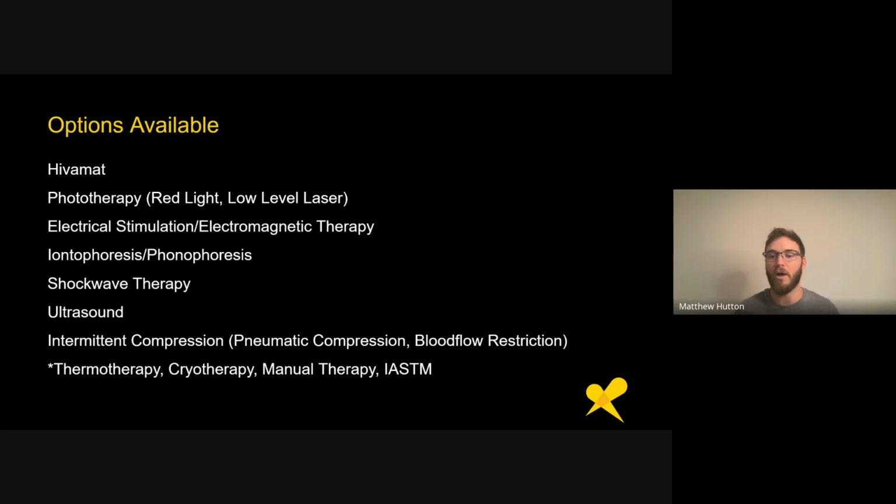Typically, it's absorbed by more dense tissues, and typically it bounces off of bone, but you also have some bony absorption, and so you have to be careful with periosteal burns if you're sending this kind of deep heating, is what we call it. If you're sending a lot of fast vibrations through a tissue and it's vibrating at a really high speed, friction creates heat, and then you're creating these burns.